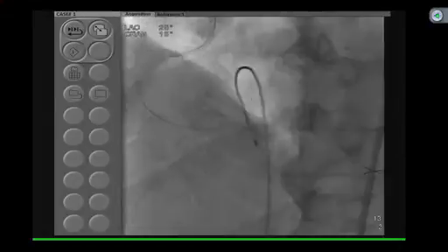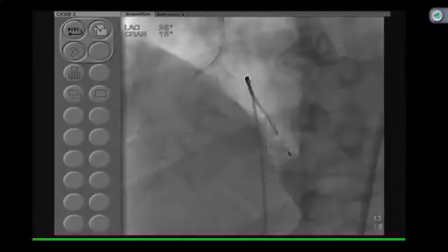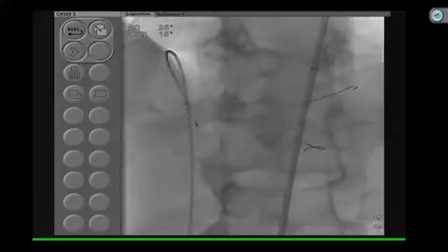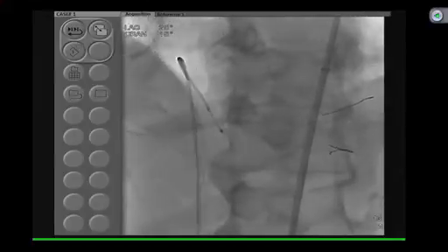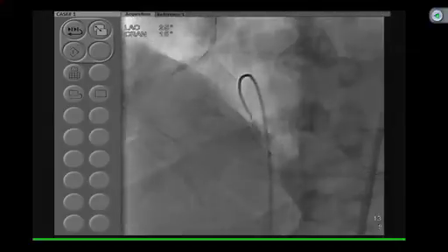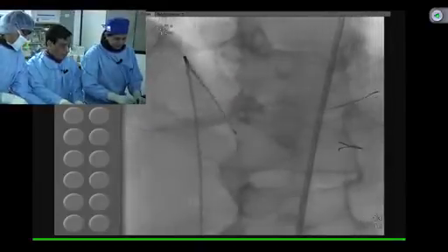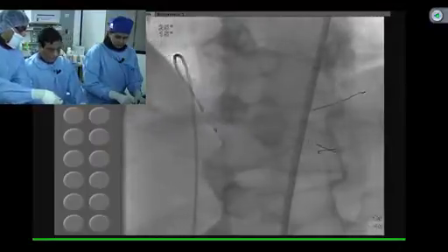Yeah, then what we will do, strategy wise, now knowing that we are getting to the time, is we will put a stent in the PDA. As I said, we do not know whether it was a bare metal or paclitaxel stent, and then we put a stent in the mid RCA. So that will be our goal. Now we are going to the PDA with a 2.75/28 because we need to cover that moderate disease, and then proximally we want 3.5 or 4.0 in the RCA. Yeah, 4.0. 4.0 by 23. Yeah, 4.0 sounds right.